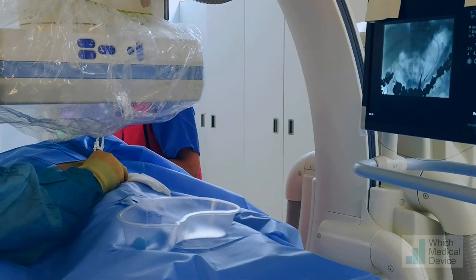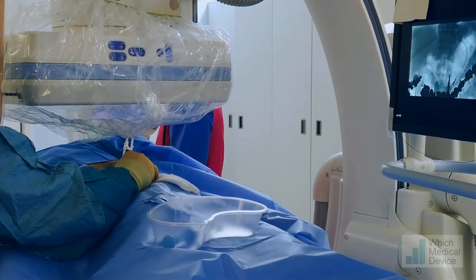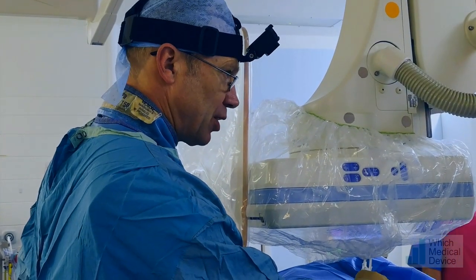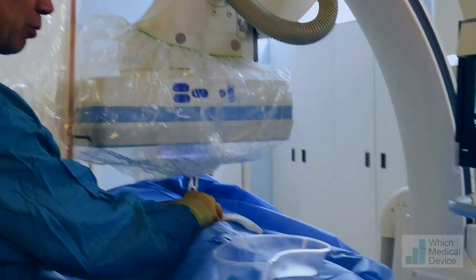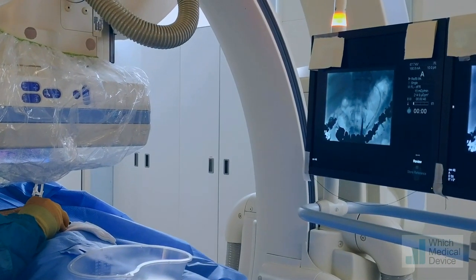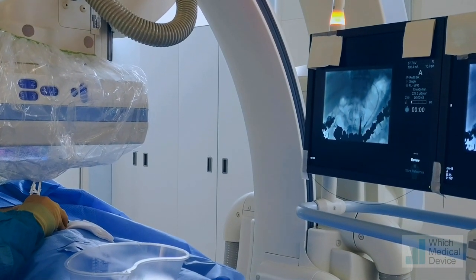Prior to injecting the air we've given some Buscopan to decrease gastric and small bowel peristalsis, which means we can distend the stomach a lot better. You can see we've got a nicely distended stomach. The optimal place for the gastrostomy is the distal body, proximal antrum. We're going to aim for a position just to the left of the midline.